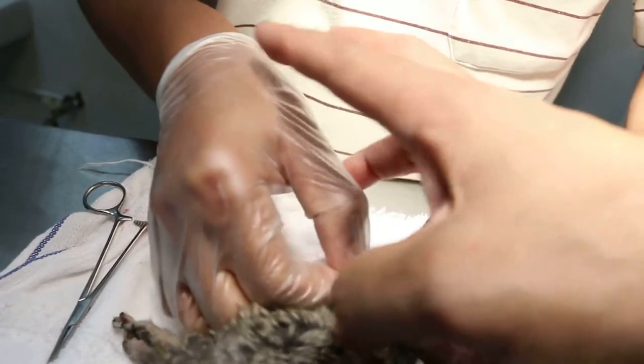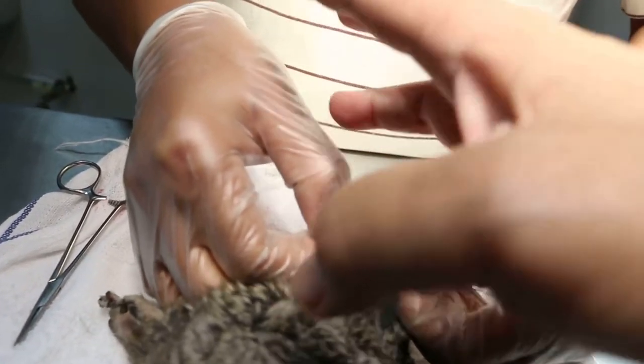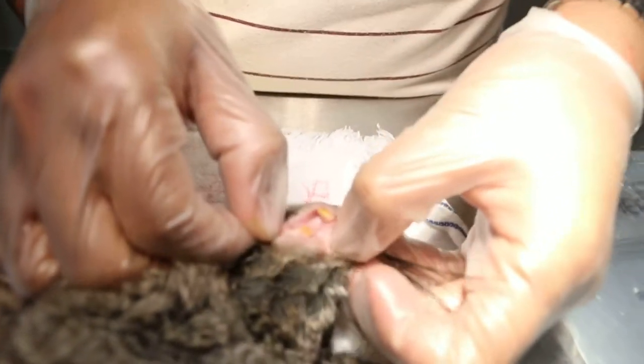It's sharp — there's a spur there, so we need to file it. Okay, we need to file it.